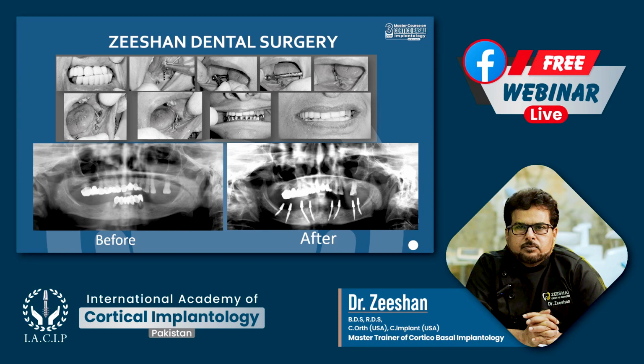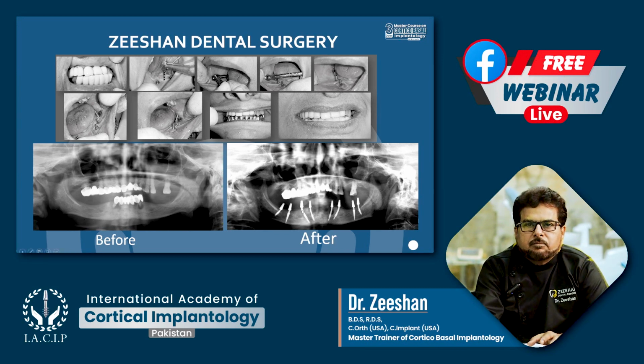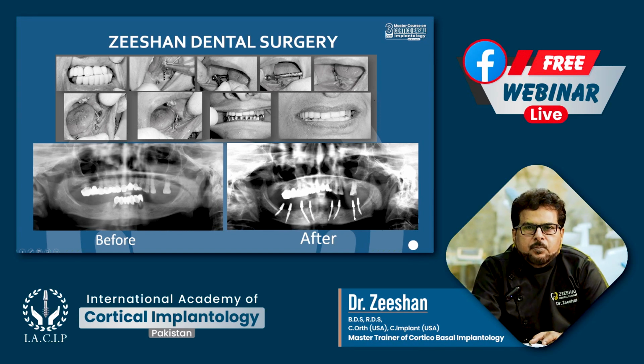For example, see in this one, we have placed implants at an angle of about 45 degrees and then bent them to get in the arch, and see the lingual bypass in this, then again bent. This one is straight, but because it's a thin implant and it's been bypassed buccally.